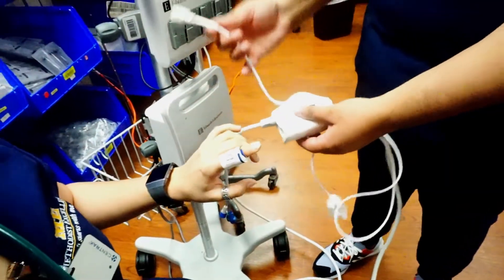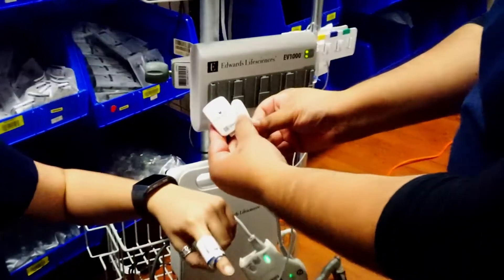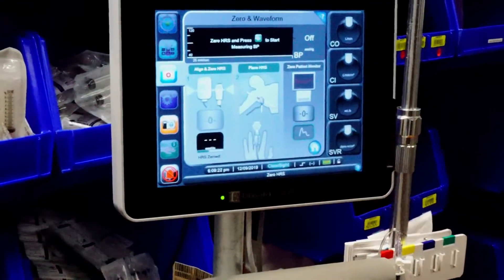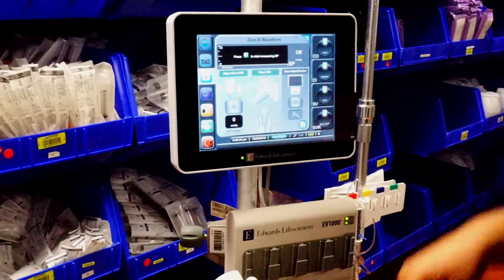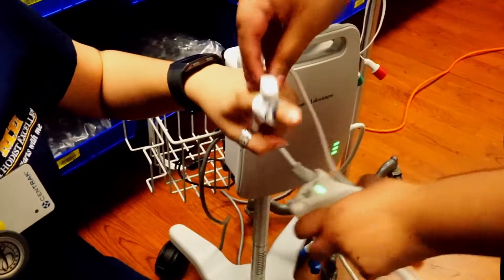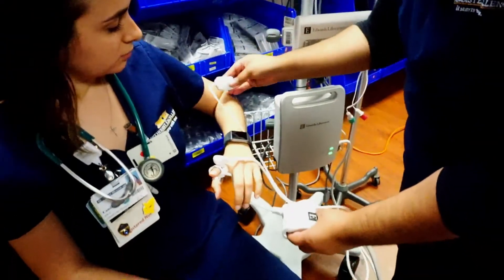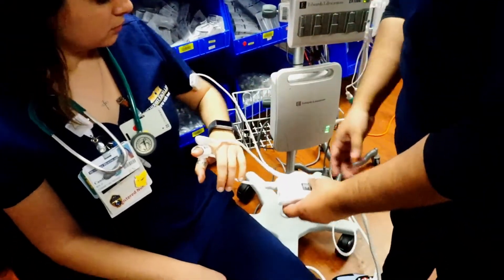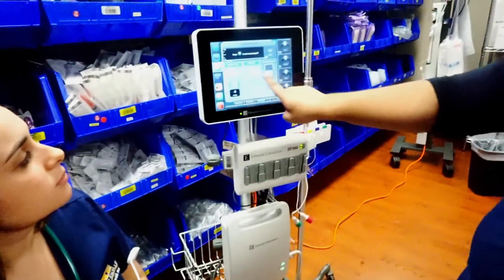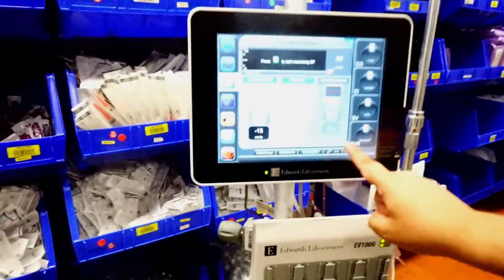To zero, align the lines just like shown in the picture, then press zero. You'll hear a chime. Slide one end onto the finger probe, and place the other end at the level of the heart — you can clip it onto the patient's blood pressure cuff or the sleeve of their gown.